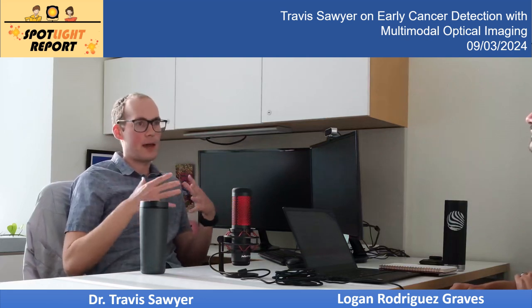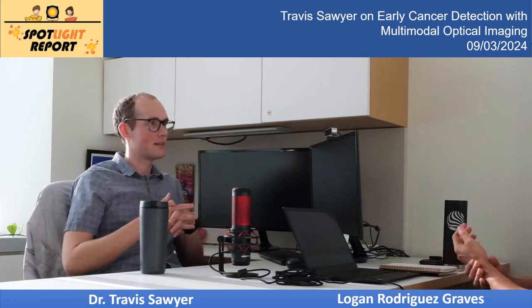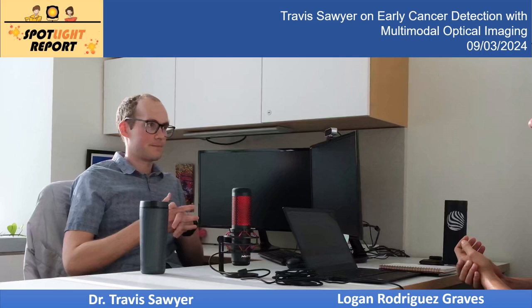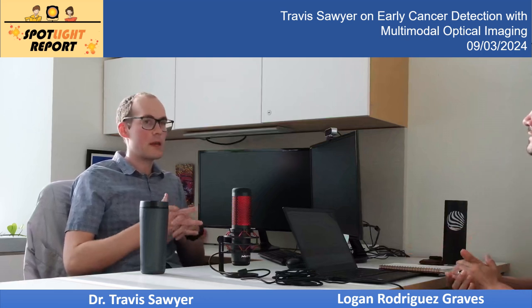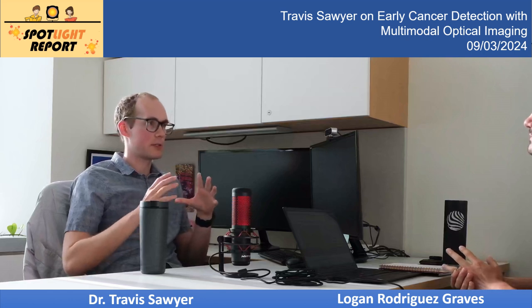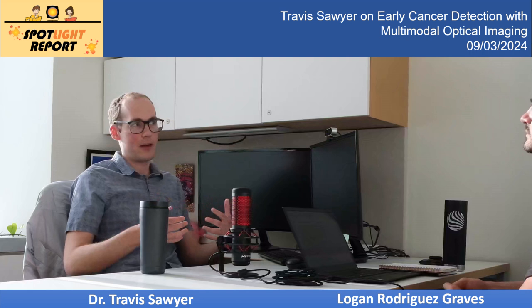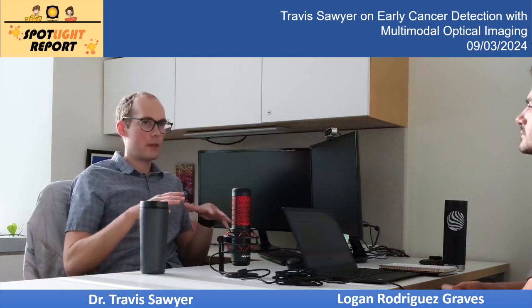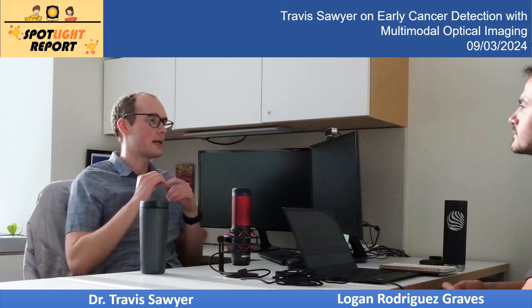But that's just a broad limitation of all of these. What's the field of view? How does that compare to OCT, I guess, because we haven't gotten to fluorescence just yet? Sure. For multiphoton, you typically are working with small fields of view. So maybe max would be like 0.5 millimeter by 0.5 millimeter. With lab-based systems, you can take multiple fields of view and stitch them together into big images.